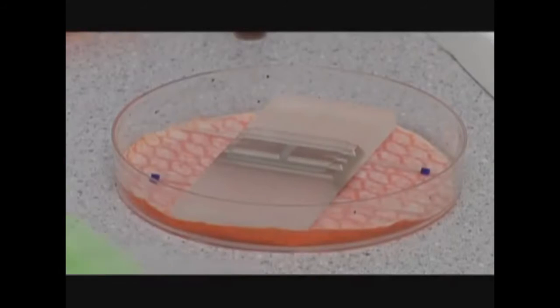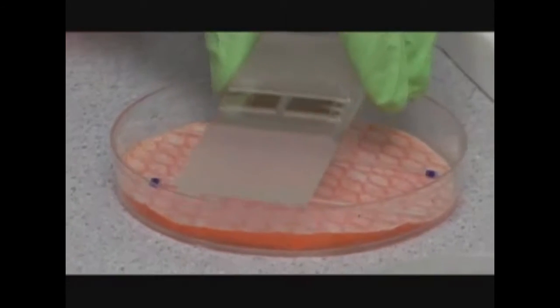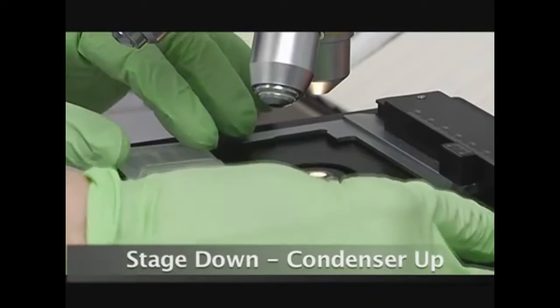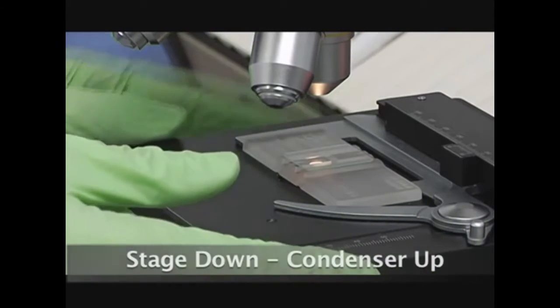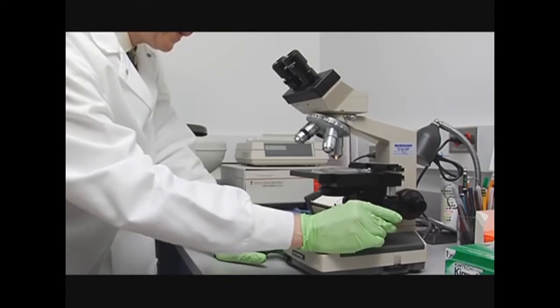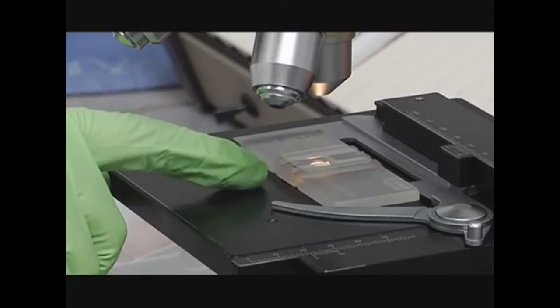Now I'll show you how to count the platelets on the microscope. First, take your hemocytometer carefully out of your moisture chamber and place it on the stage of your microscope. The microscope stage should be all the way down and the condenser up. Then adjust your stage so that the spot of light is right about there on the hemocytometer. That's where your rulings will be showing up.